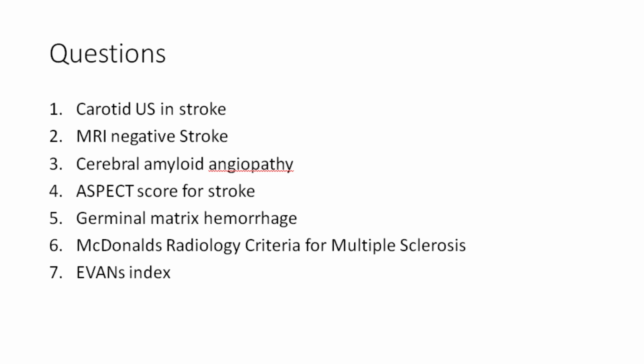Germinal matrix hemorrhage. I believe you must have seen those before. How many of you report that? How many of you report that? I have seen reports and nobody documented germinal matrix hemorrhages. Reason for that? Because there were no GRE images. Now patient is coming to me with epilepsy or cognitive problem, and nobody ever told them that they have germinal matrix hemorrhages from childhood.